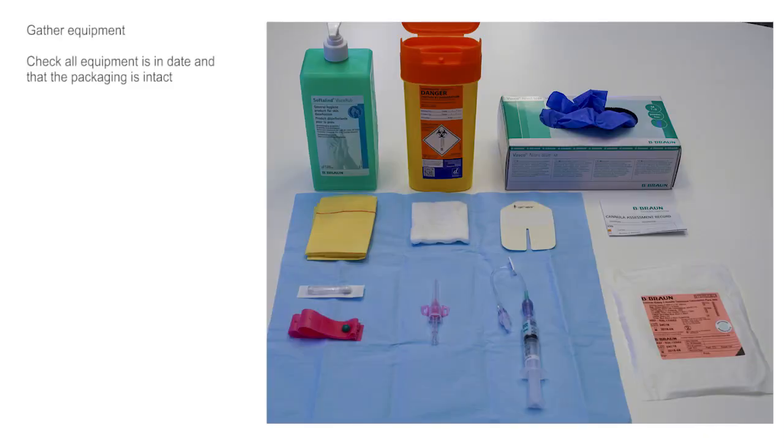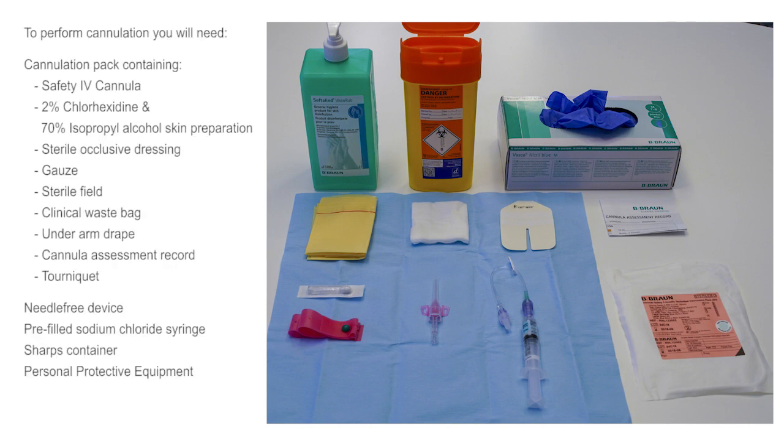Gather your equipment. Check that all equipment is in date and that the packaging is intact. To perform cannulation you will need a cannulation pack containing a safety IV cannula, 2% chlorhexidine and 70% alcohol skin cleaning preparation, a sterile occlusive dressing, gauze, a sterile field, clinical waste bag, an underarm drape, and a cannula assessment record.